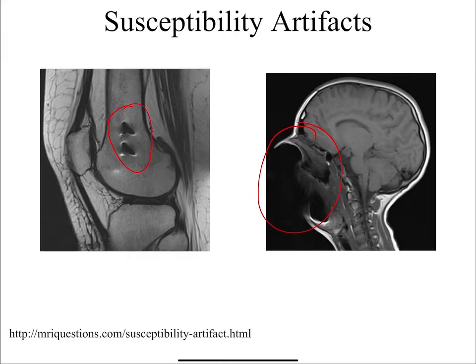Well, it depends on the mass of it. If I forget to take off my belt, it is slightly magnetic and I can feel the magnetic field tugging on it, but it's not going to go flying and kill me. But in general, I do take it off. Sometimes I forget and I'm in the magnet and I'm like, whoa, what's that?